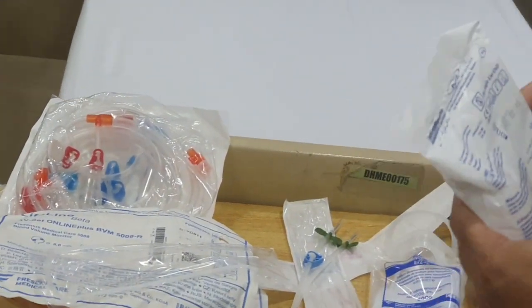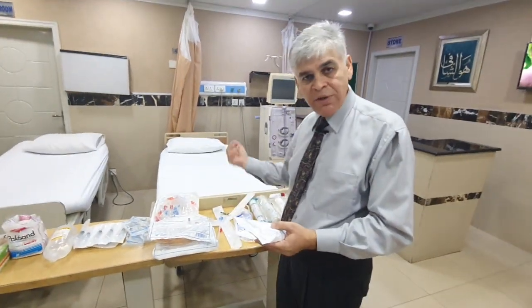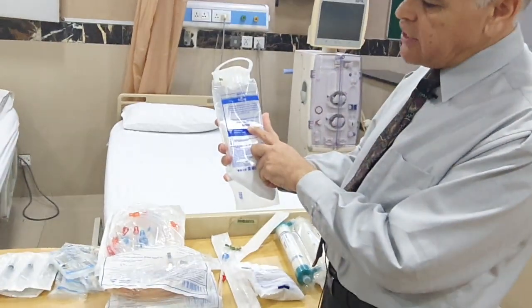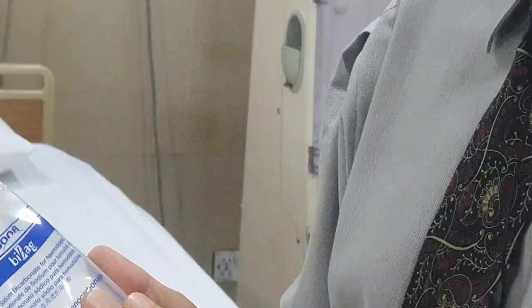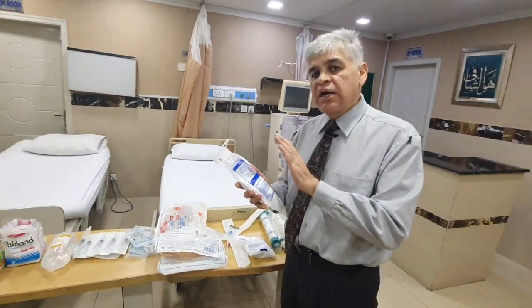This is usually mixed with something called an A part, or an acid part, because on its own it doesn't work. So it has to be mixed with an acid. But here what I've got is what we call a bibag, a Fresenius bibag. This attaches to it, and then you need an A part anyway. This is called a B part. B part is the basic part. A stands for the acid part.